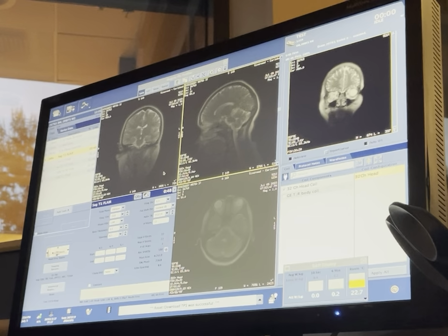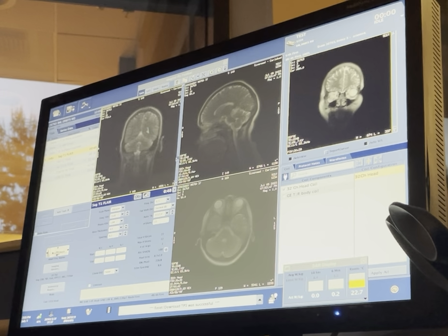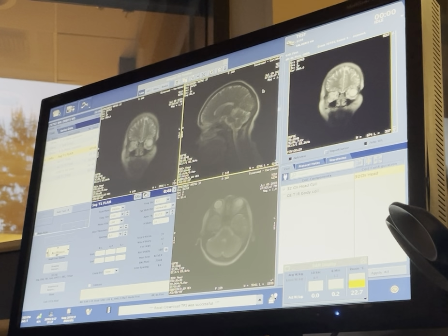There we go. This bottom one just goes straight left. Just go straight left. Yeah, there you go. And slightly up. Okay. Yeah. So let's go up one slice. Now go down one slice. Nice. Yeah, that's probably the one. Okay. And now let's go find the globes. For all of them? For those two, yeah. Keep going. That's it? Okay, that's what we got.